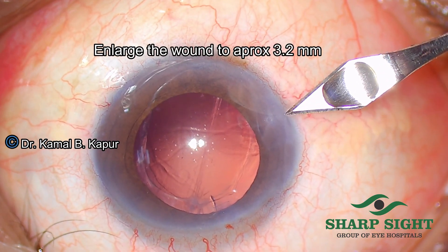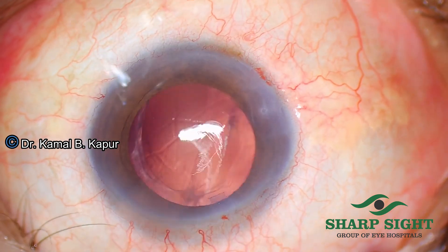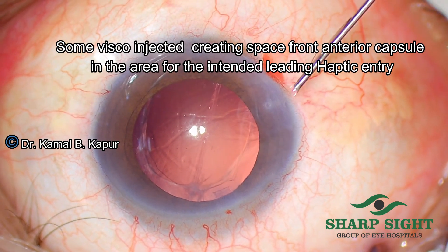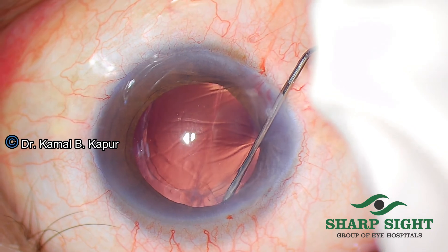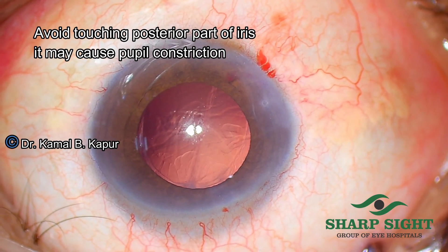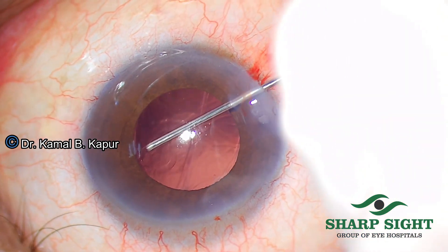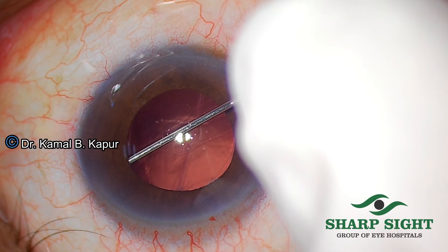We enlarge the wound to approximately 3.2 mm because in this particular technique we do not use the wound assist technique, but we have to insert the cartridge tip inside the wound so as to negotiate the haptic behind the iris. Just before we get the cartridge loaded, we inject some more viscoelastic under the iris, making sure that we do not touch the posterior surface of the iris because that might cause constriction of the pupil, as was noticed in this particular case.